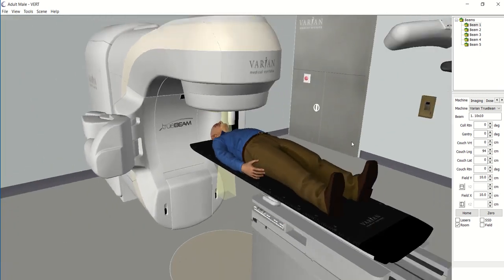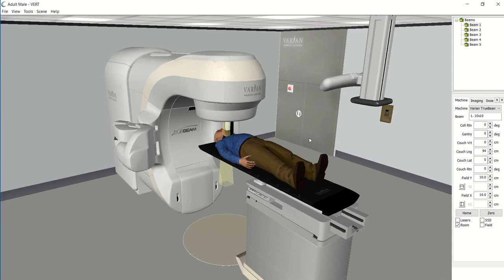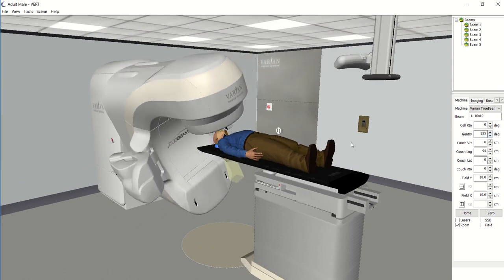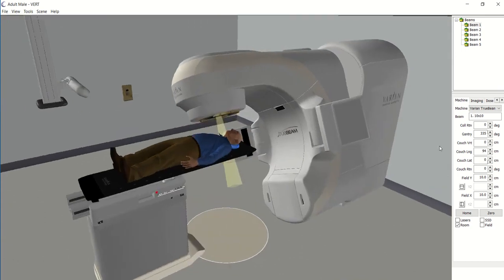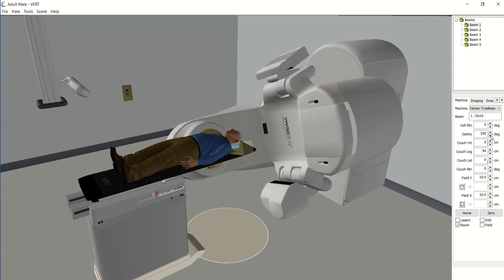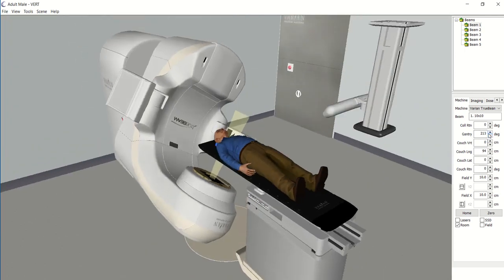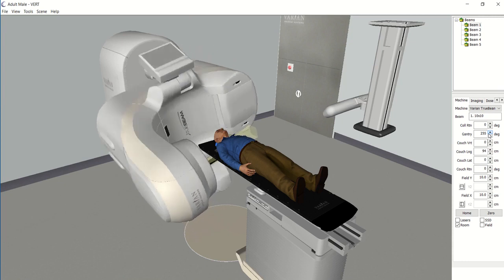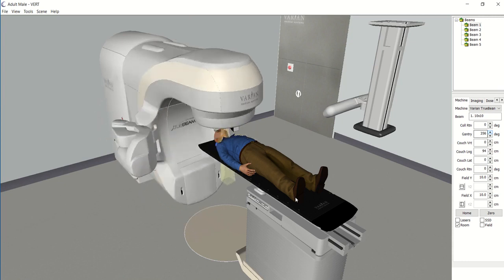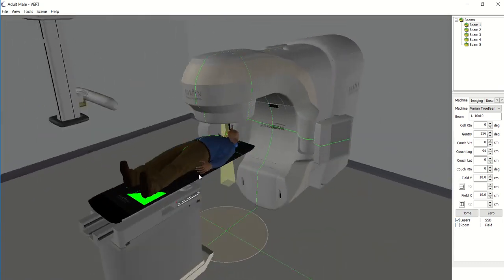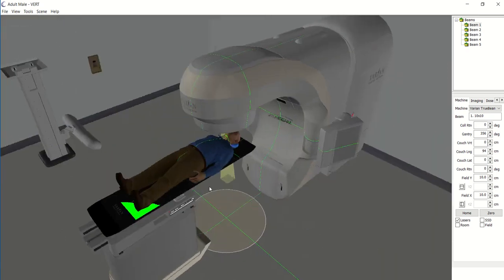When you're out on placement, you'd be setting up these patients into the right position, and then once you leave the room to start the treatment, the machine actually moves around and delivers the treatment from different angles — and it does not move that fast. To set up our patients, we turn the room lights off, work in the dark, place these lasers on within the room, and this is what allows us to line up our patients ready for treatment.